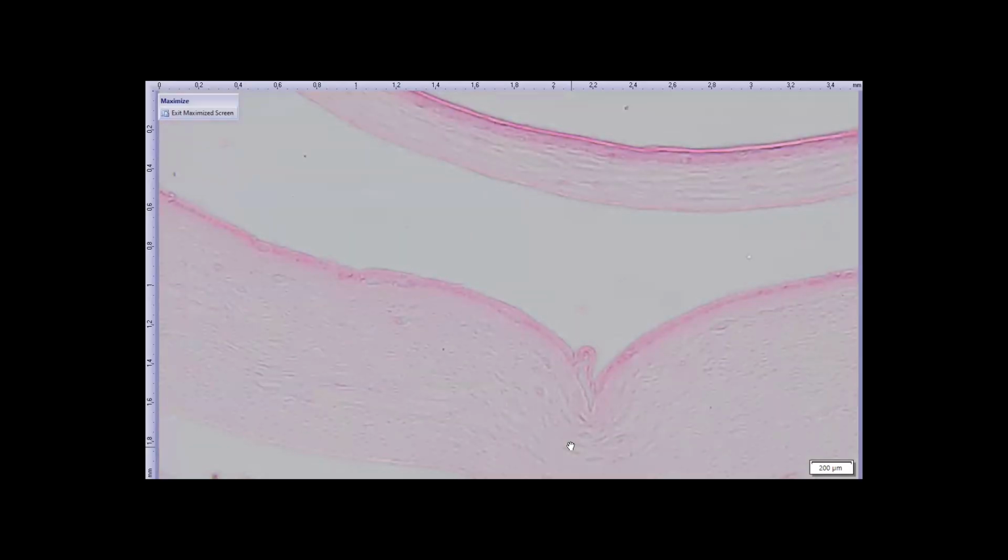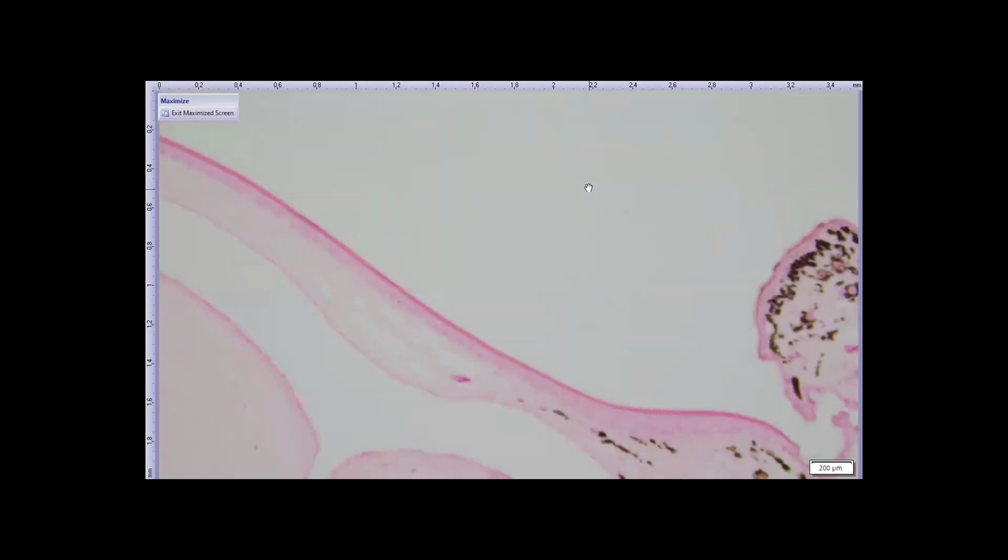Here's the cornea. And you can see, now we can recognize attenuated epithelium, but there is definitely an epithelium on the cornea, unlike the snake. The gecko cornea. So here's the subspectacular space, or maybe we could call it the subbrillar space. I'm not sure. And again, it extends back into what would be analogous to the fornix of the conjunctiva.